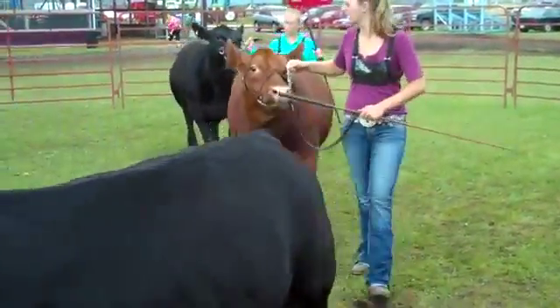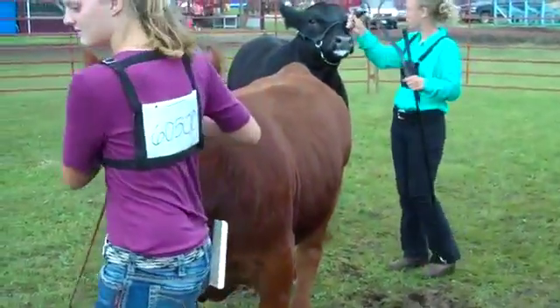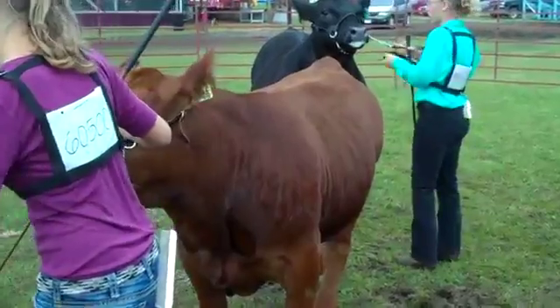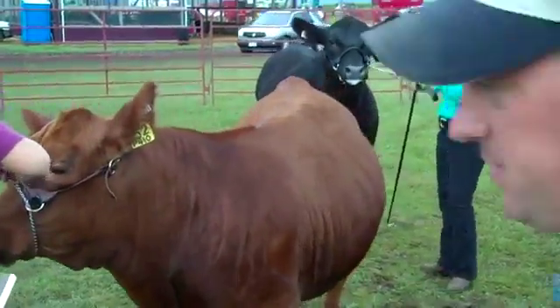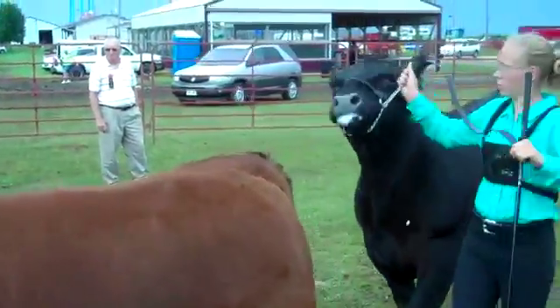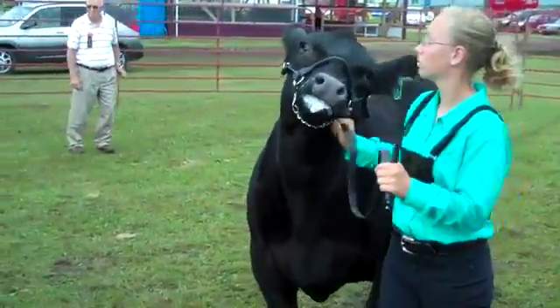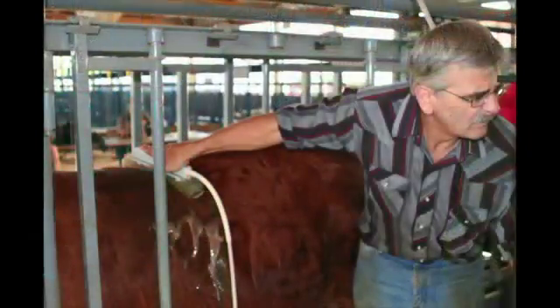Ultrasound is a technology that can capture carcass measurements such as back fat and loin muscle area without harvesting the animal. Although there are many pros and cons to using either carcass data or ultrasound, the important thing is being able to capture data and then being able to interpret what it means.